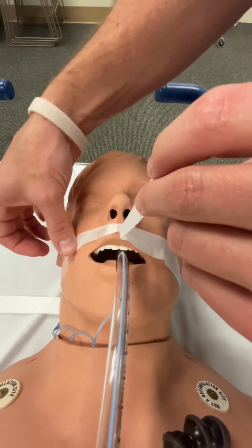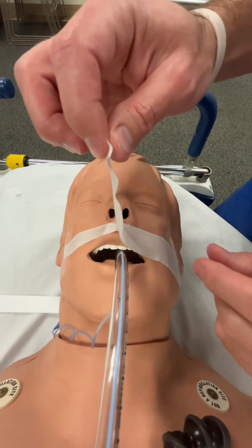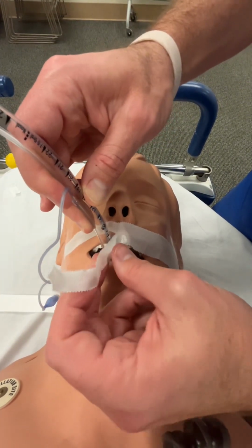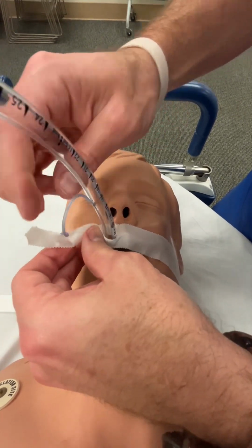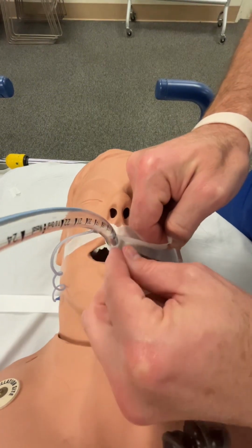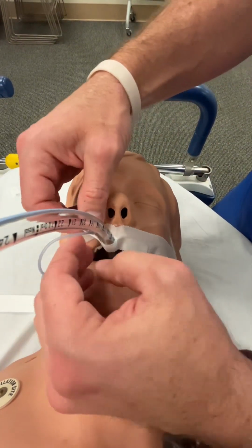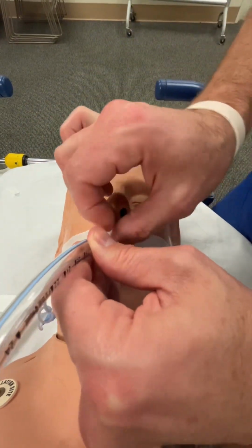Now you can just lay that upper piece of tape along the upper lip, create a courtesy tab if you'd like. You're going to make sure your tube is aligned right to where that split is in the tape, and you're going to wrap it down and around. Make sure you are not crimping off your pilot line. And I'm going to wrap it around. And as I wrap it around, you want to kind of candy cane it up. You don't want to keep it all in the same area as you're wrapping it around. And create a courtesy tab and secure it.